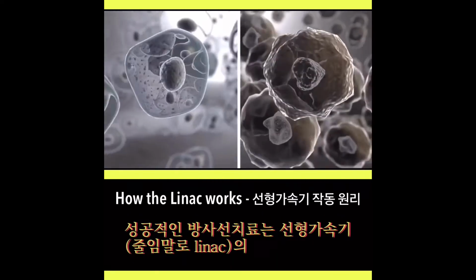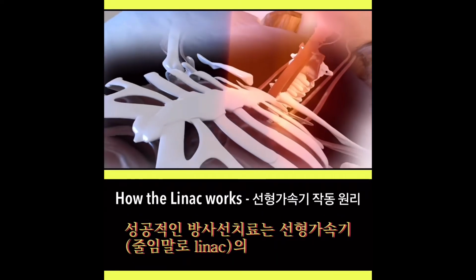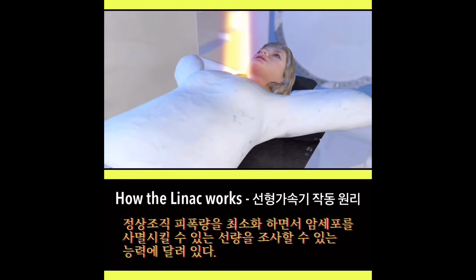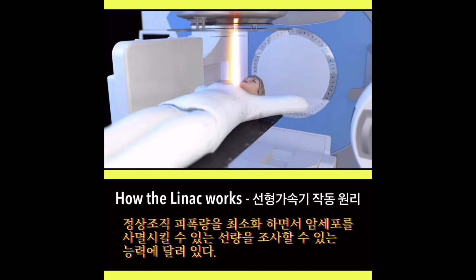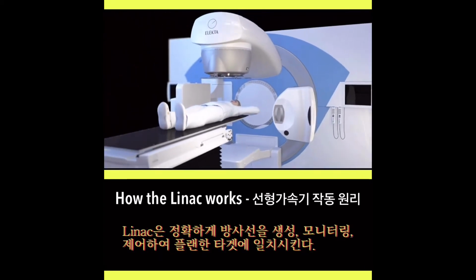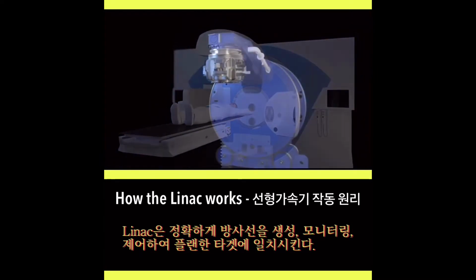Successful radiation therapy depends on the ability of the linear accelerator, or LINAC, to deliver a tumoricidal dose of radiation to the tumor, while ensuring minimal radiation of normal tissue. The LINAC accurately produces, monitors, controls, and conforms the radiation beam to the planned target.